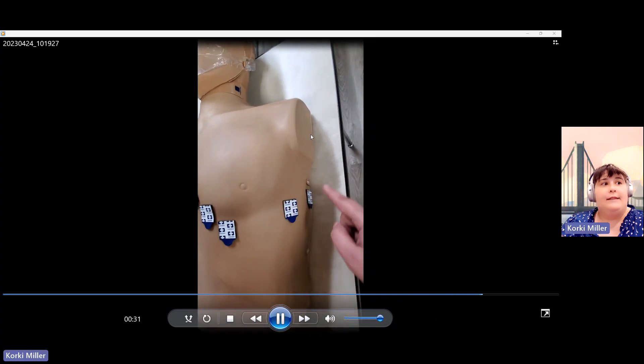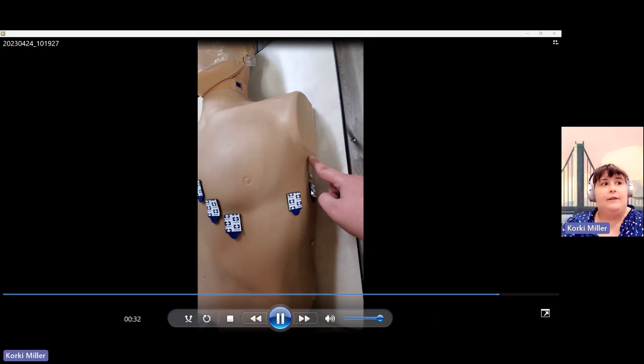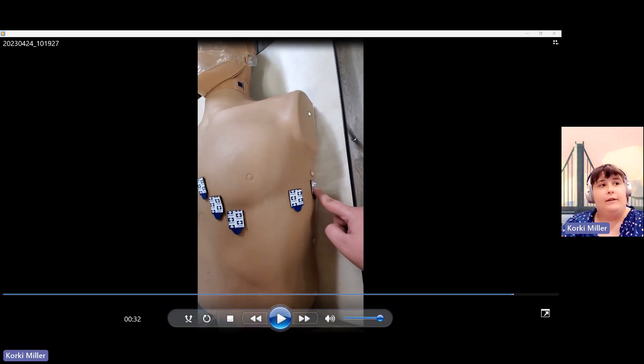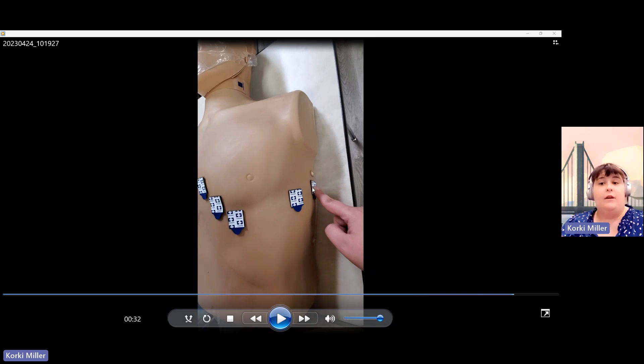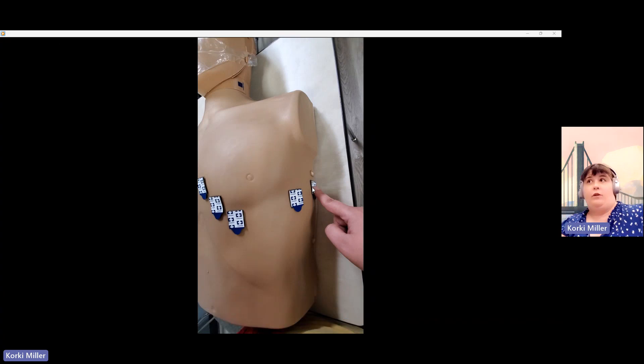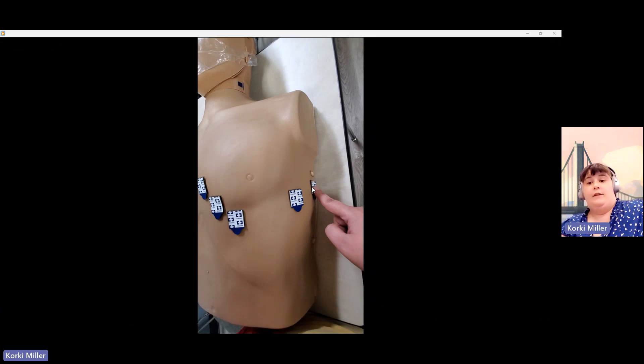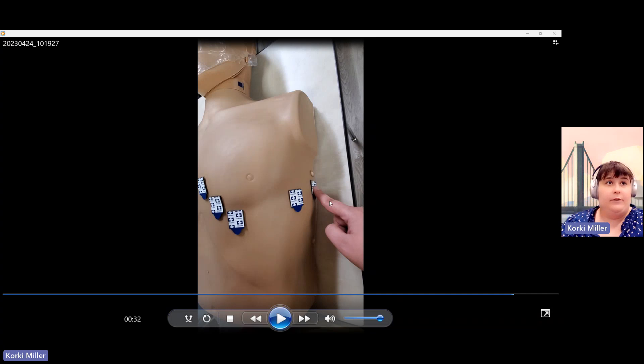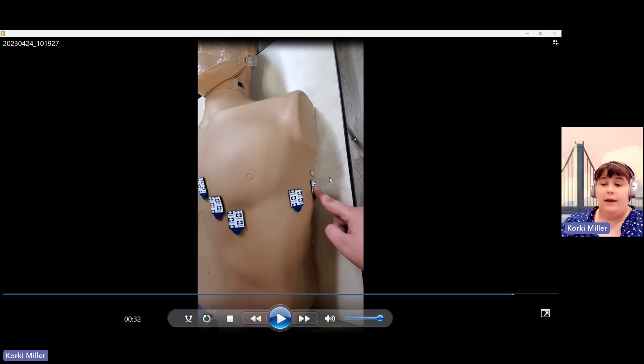And then on the V6, it's going to be right on, if you cut the body in half right where the midpoint is, so past the armpit or towards the end of the ribcage, that's where the V6 is going to go. That would be the proper placement for the EKG leads.